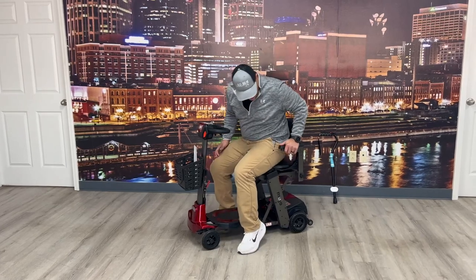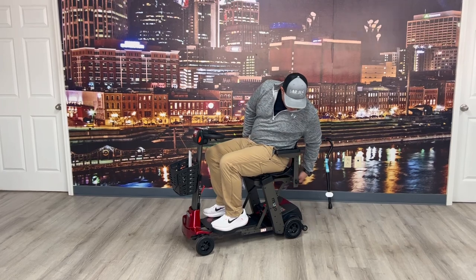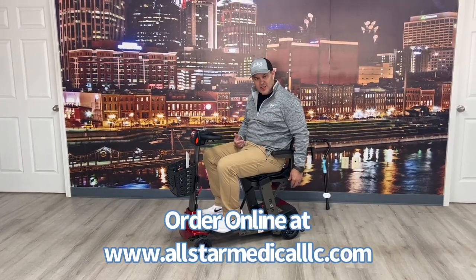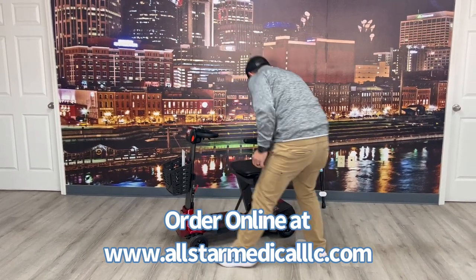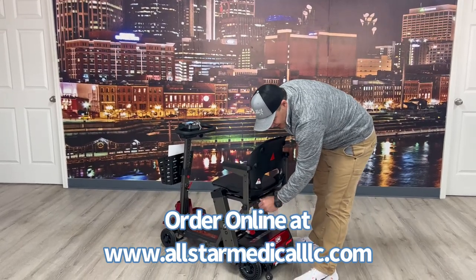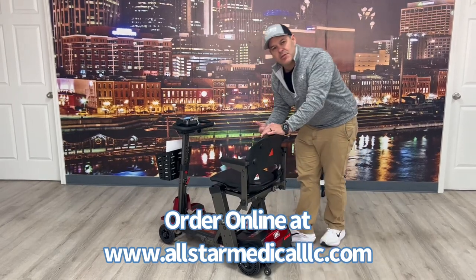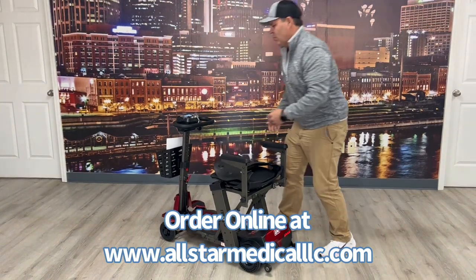The seat is 16 and a half inches wide, and what's nice is it has two mounts that make the armrest height adjustable — this is at the lowest setting. The armrests flip back, and on the back side you can extend the width, so if you're a little larger in the hips you can still get within the seat comfortably.